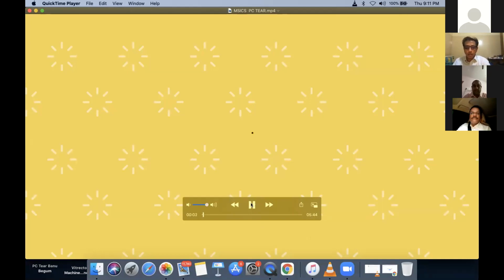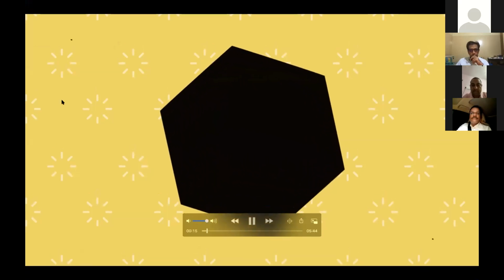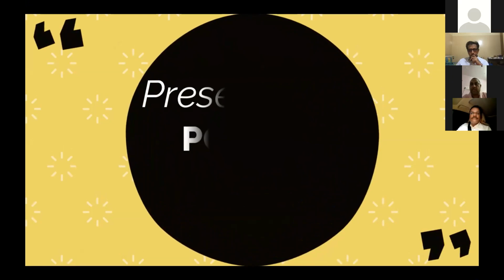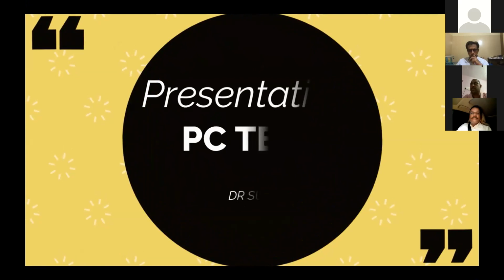Everyone, I'm Dr. Sushil Kakanki. I'll be showing some of my videos on a posterior capsular tear. Posterior capsular tear is one such complication that makes us sleepless at night, and the consequences mainly are lens drop, a decentered IOL, prolonged inflammation, cystoid macular edema, or retinal detachment complications, and so on. These will start coming into our dreams, and that keeps us sleepless for so many days after the posterior capsular tear has occurred in one case.